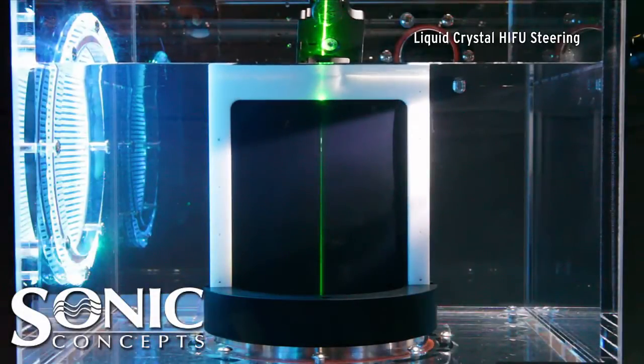The H300 transducer is attached to the bottom of a water-filled tank with its spherical bowl radiating upward. A black liquid thermochromic sheet is positioned co-planar to the transducer. The HIFU source focuses energy to the size of a grain of rice around the geometric axis of the HIFU array.